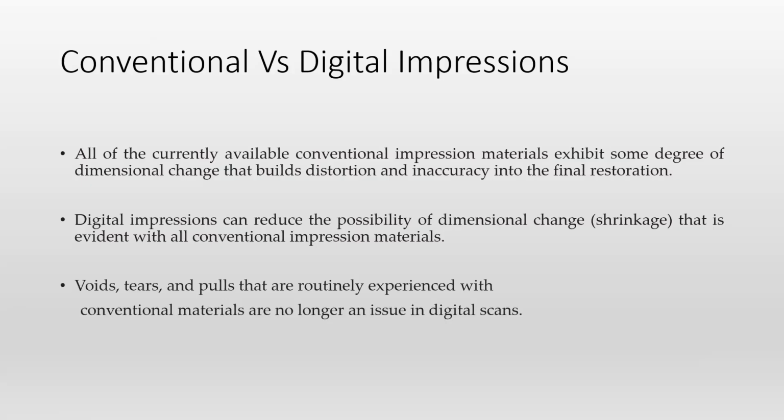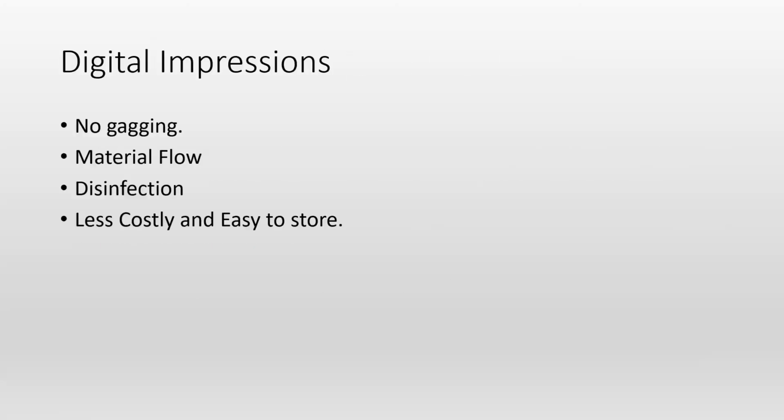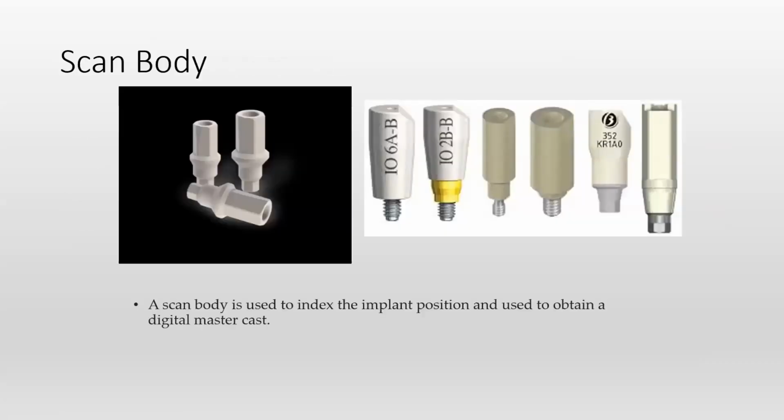So voids, tears, and drag of the impression can all be avoided with digital scans. The main advantages are there is no gagging, no material flow issue, easier disinfection, less cost, and the impressions are easy to store as they are in soft format.